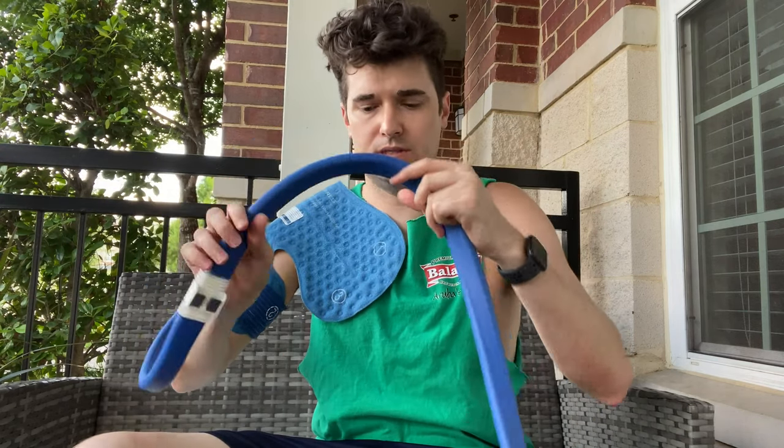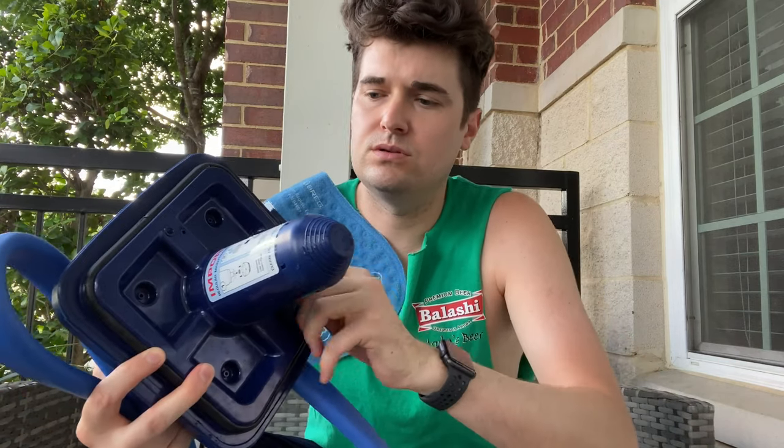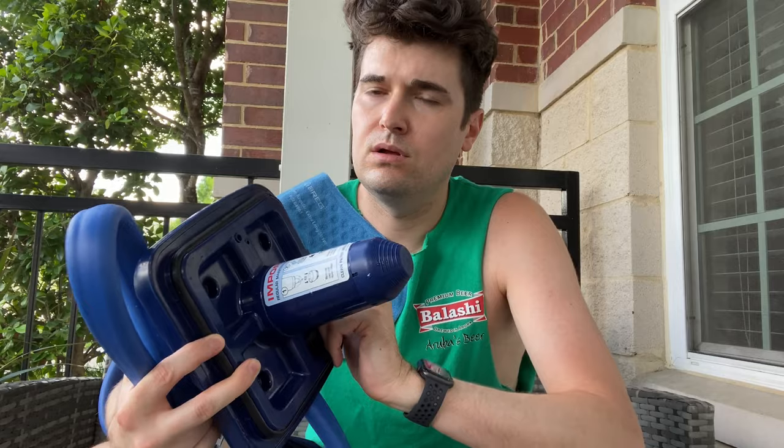It's got this tube, connected to this cooler unit. Filters in and out of here. They don't recommend using small ice — I think the small ice can mess with the filtration.